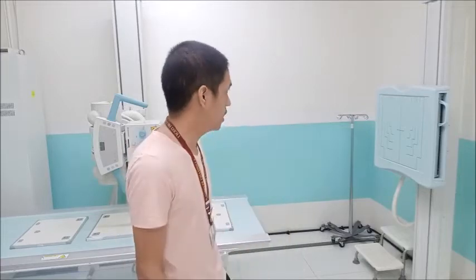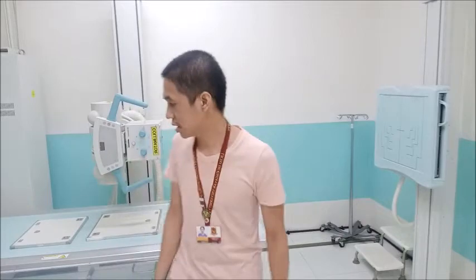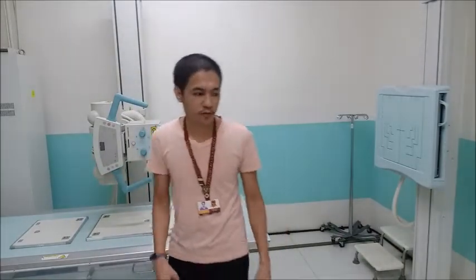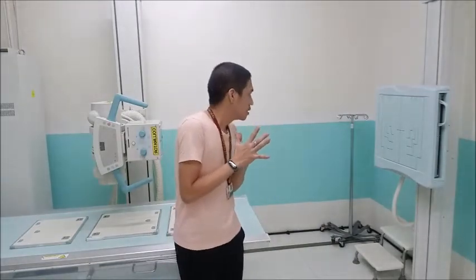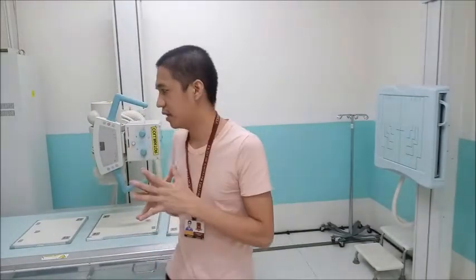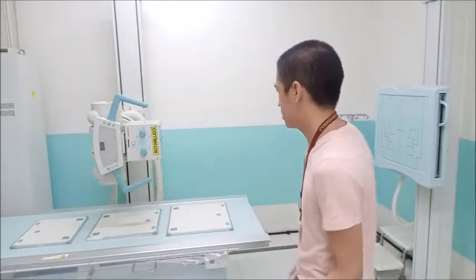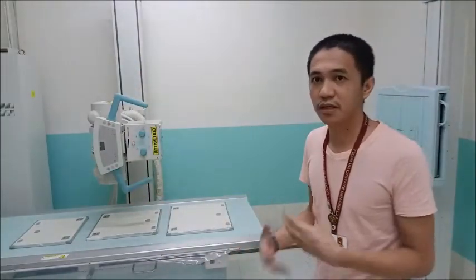Okay, good morning. So this video will be related to just additional knowledge about the different examinations. First, in general, what to do or what to prepare for my examinations. So we have here our setup, the regular setup in every general radiography room.